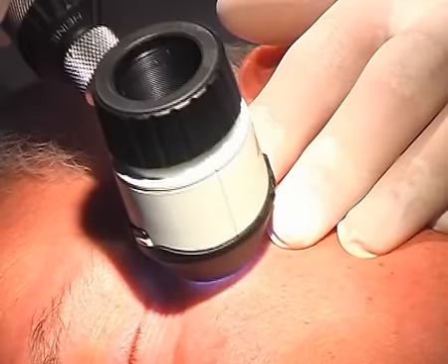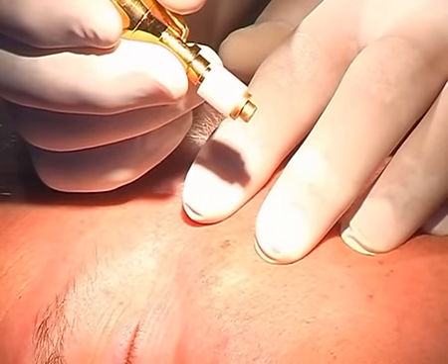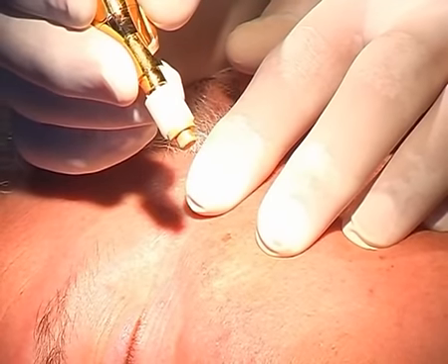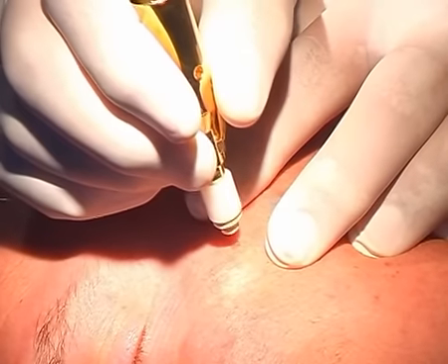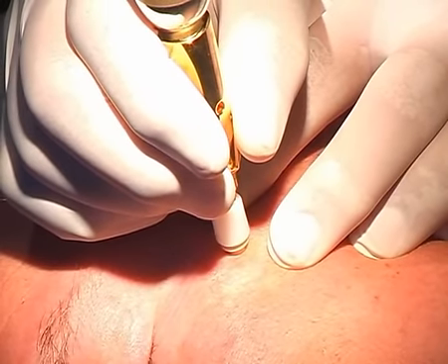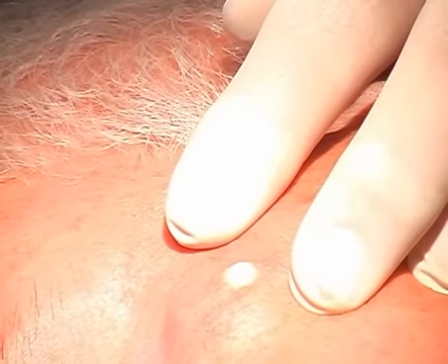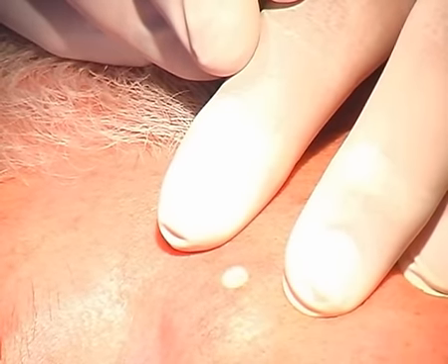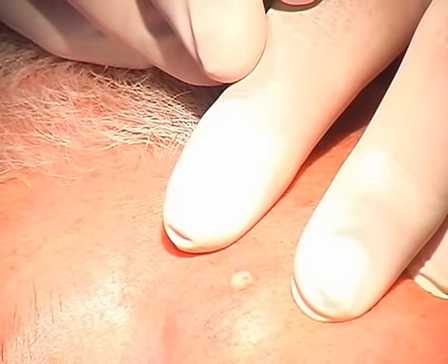Again on the same patient, another seborrheic wart, rather flat, that can be detected with a dermatoscope. We work again with the contact applicator, which has to be cooled down first for 10 seconds. After this, we are going to treat for 6 to 7 seconds while pressing the lever. The tissue smoothly thaws and once the scab is formed, it will fall off after 10 to 14 days. The patient felt twice a moderate pain, disappearing after a few seconds.